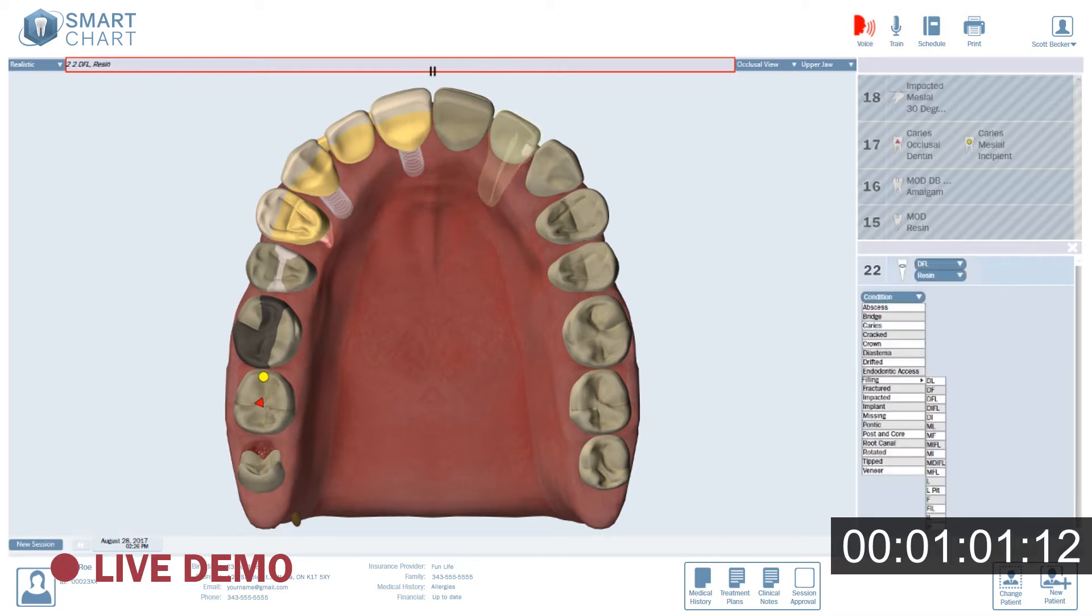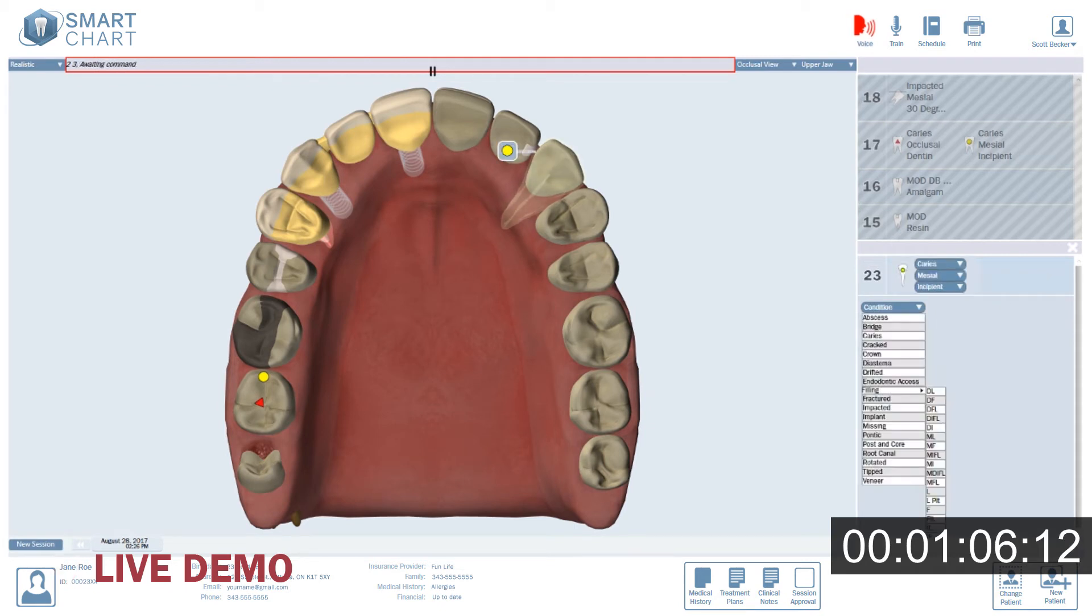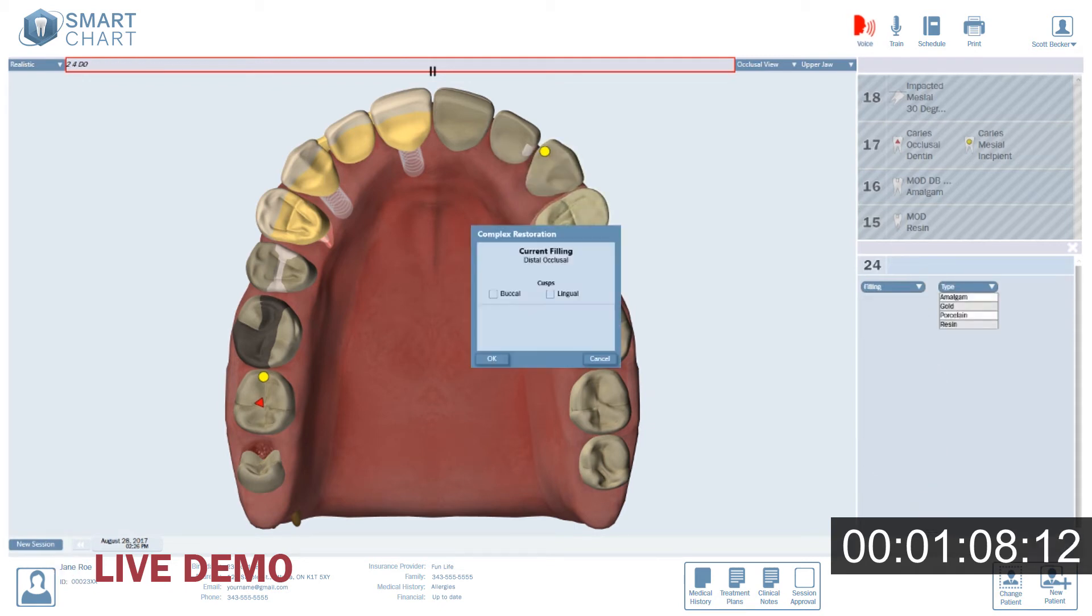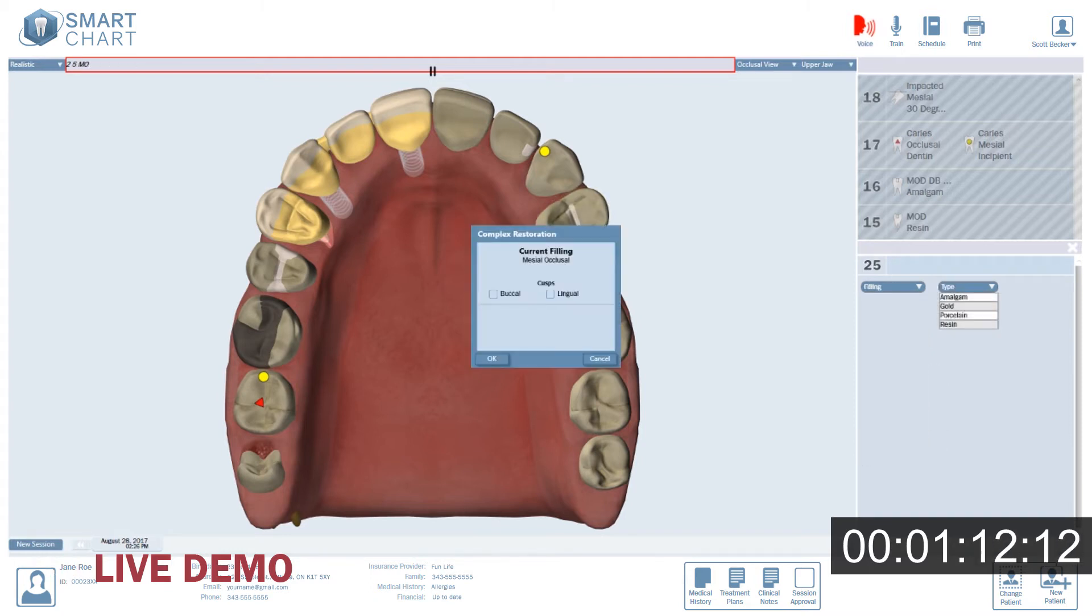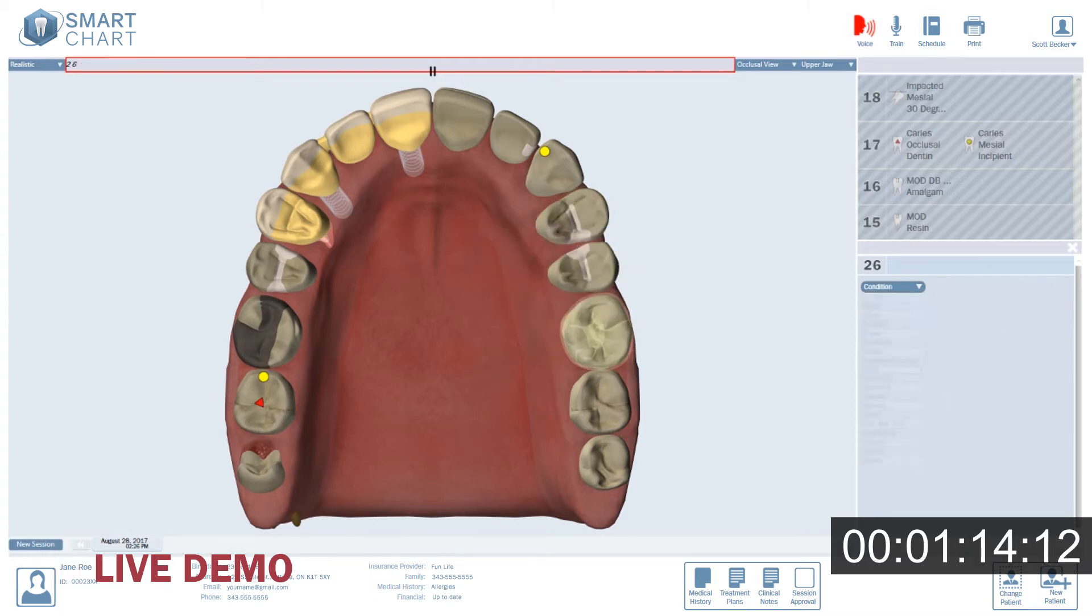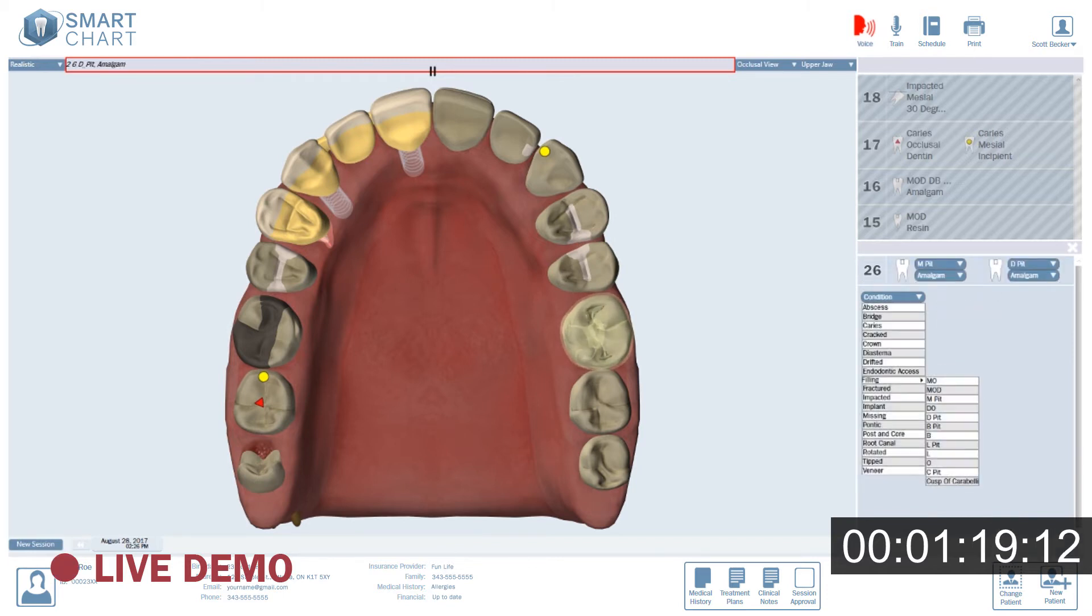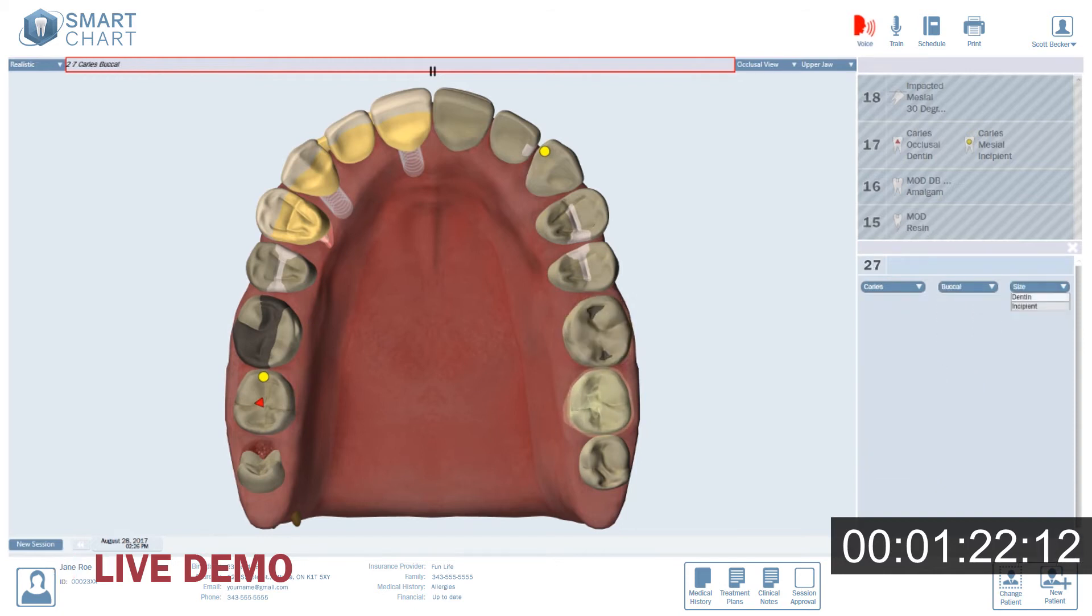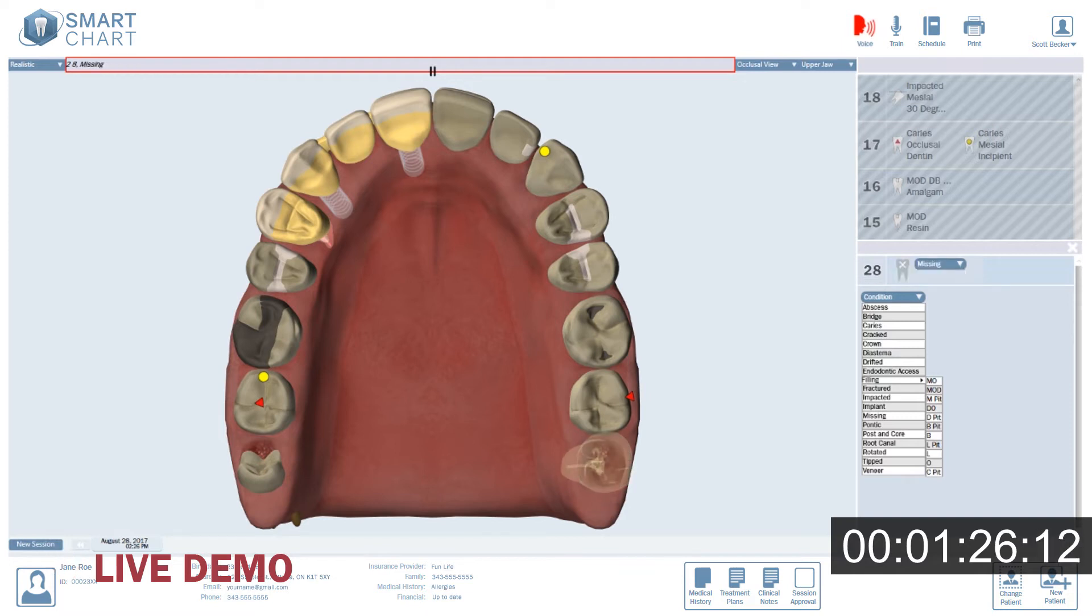2.3. Caries. Mesial. Incipient. 2.4. DO. Resin. 2.5. MO. Resin. 2.6. Mesial pit. Amalgam. Distal pit. Amalgam. 2.7. Caries. Buccal. Dentin. 2.8. Missing. 3.8. Missing.